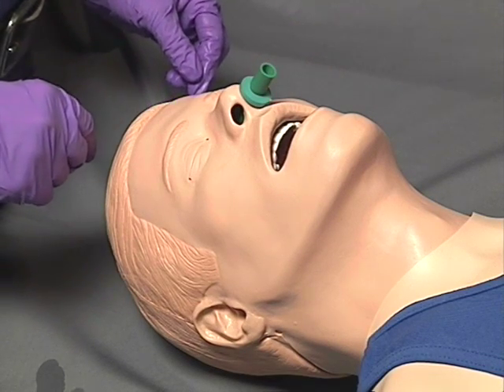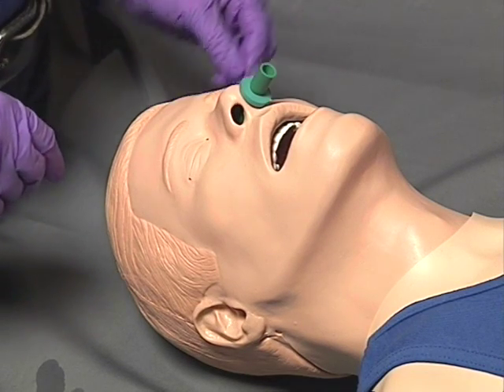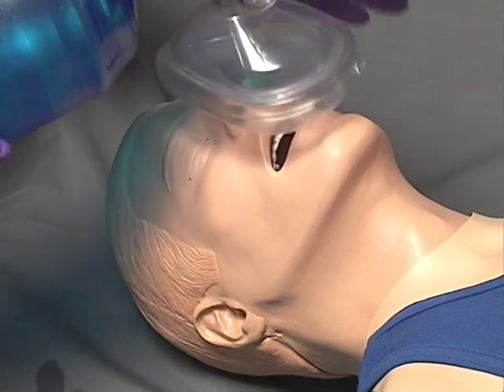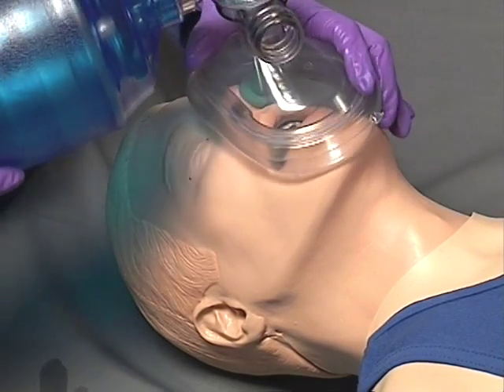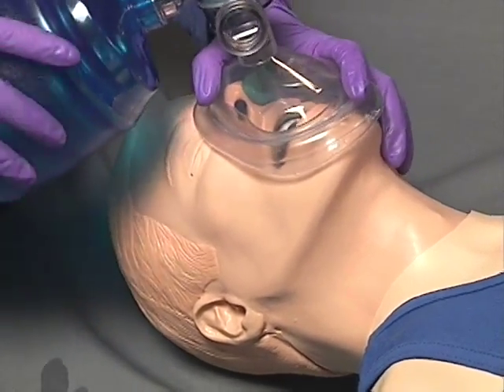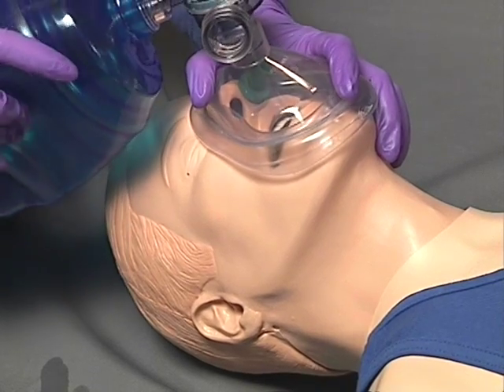Continue to insert the nasal airway into the oropharynx. Once the nasal airway is in place, the last step is to check for adequate air exchange.